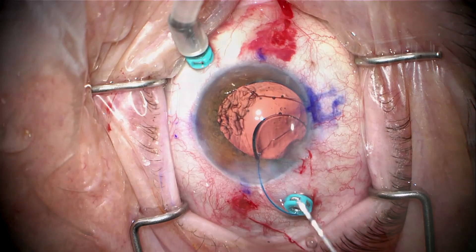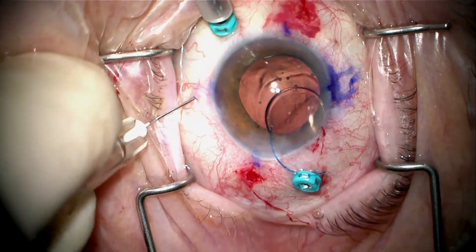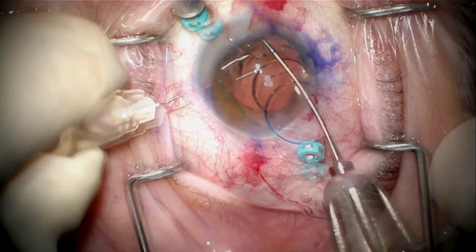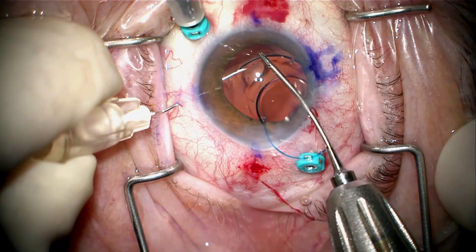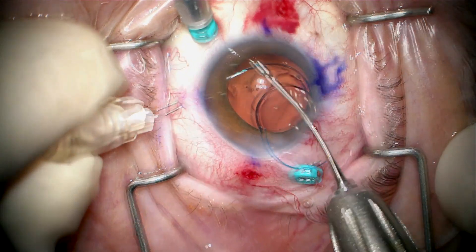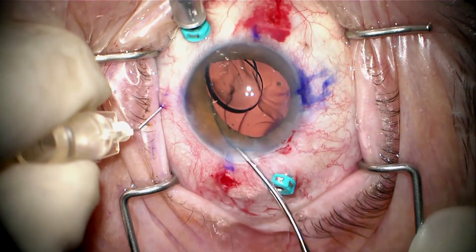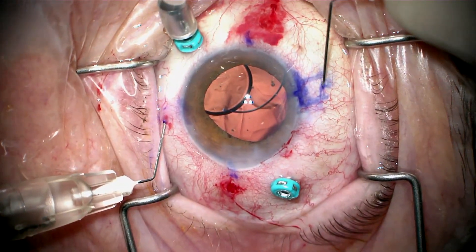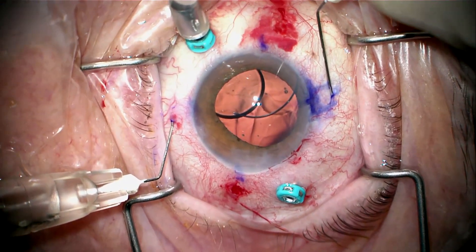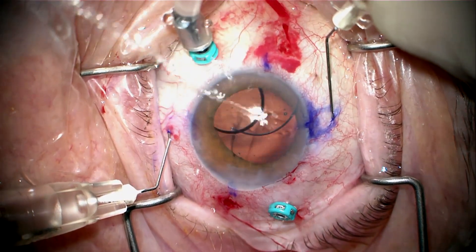We'll put more viscoelastic in to protect the cornea. Here's my first needle pass. This is a really big eye so I'm going back about 2.3 to 2.4 millimeters from the limbus. The haptic of the AR-40 is thicker than the Zeiss 602 haptic, so it has to be guided directly into the tip of the needle. Here I'm making my second needle pass, and I want the needle tunnel long enough so that the haptic is secure in the sclera.